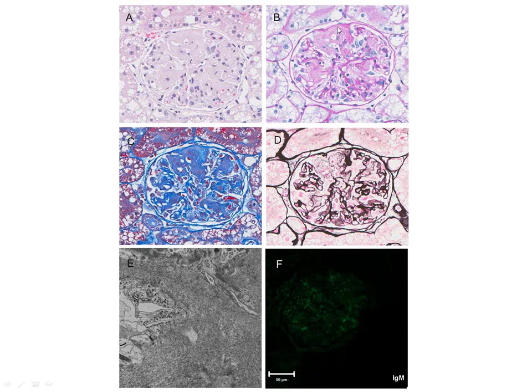So waxy has often been associated with amyloidosis, and I think that's why they say that this is a waxy appearance to the PAS. And since we don't really have that same history, but I do think it will help you remember that on a PAS, it's going to look a little different than normal GBM.